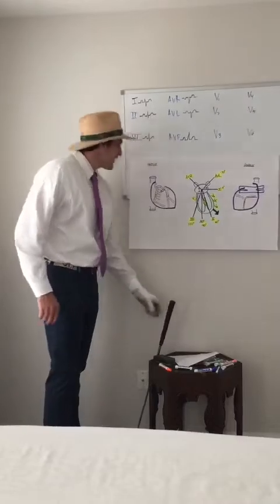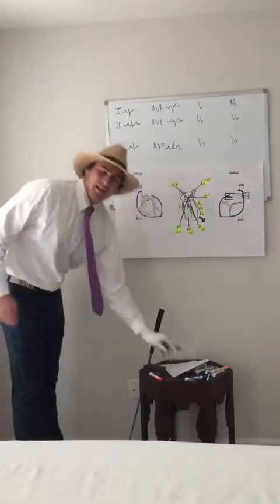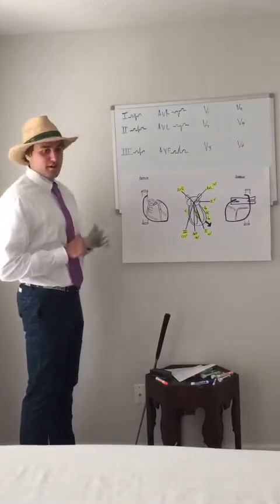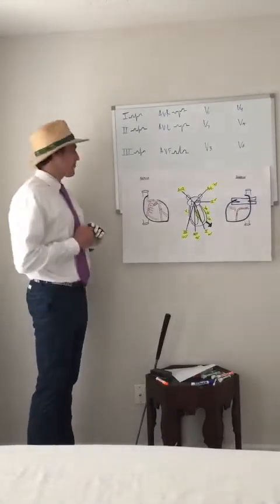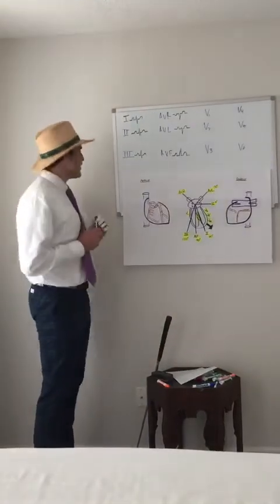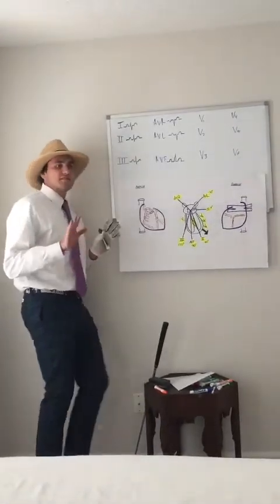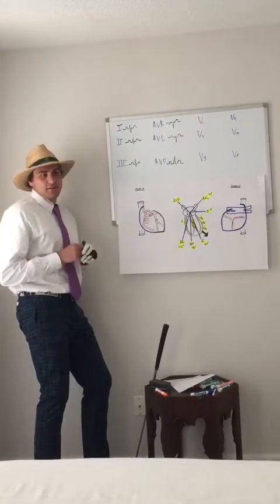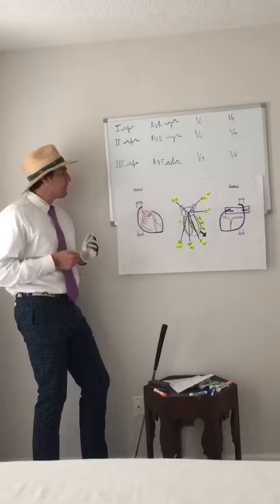Close putt. Well, again, we're back here with Bonehead EKG, and we're going over some fundamentals which are very important for your understanding. Remember, we don't like memorizing over here at Bonehead EKG. So, Will, this whole axis thing, I really don't know how to calculate it, and it seems kind of complicated. Why don't you take us through it?